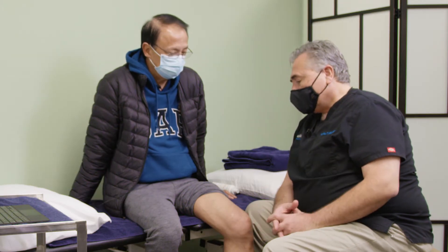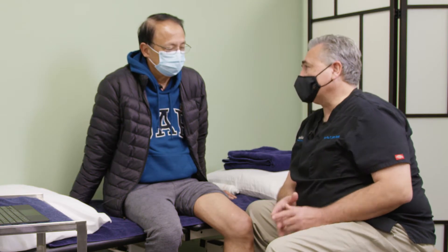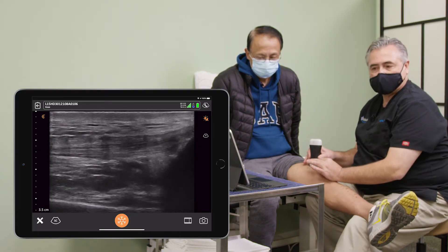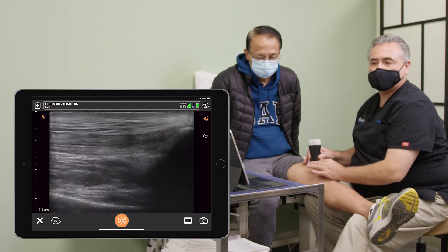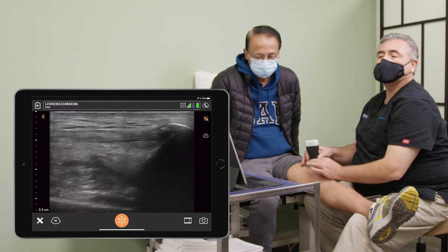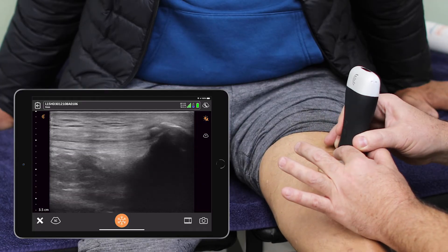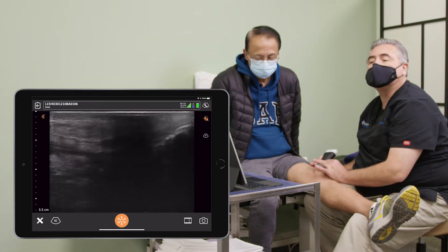So today, Orlando, I'm going to be using a tool that will look inside. We'll take a look at bone and see what is actually happening in there. The first thing I'm going to do in imaging is to place the probe in long axis over the top of the knee. I'm looking for the base of the femur, and above that you will see the quadricep tendon. Coming into view here is the patella, and what I'm looking at is the little white spurs — the little traction osteophytes that we're seeing there — but there's not a lot of darkening. We're not seeing a lot of reactive effusion around that site, and the suprapatellar space is not filled with a lot of fluid.